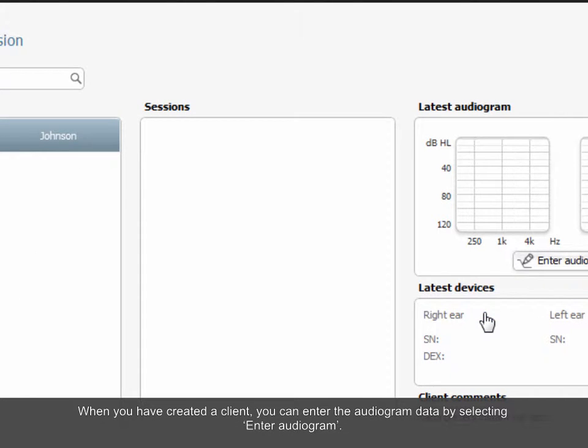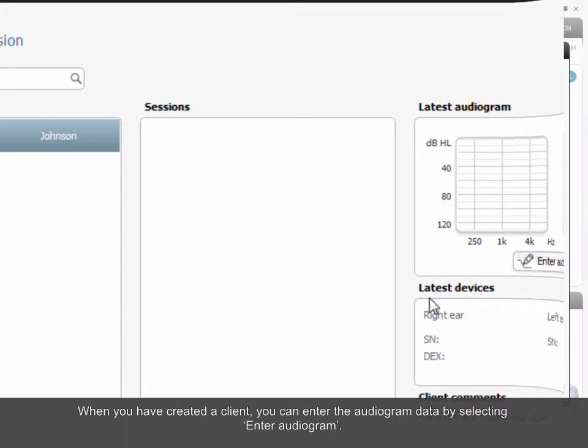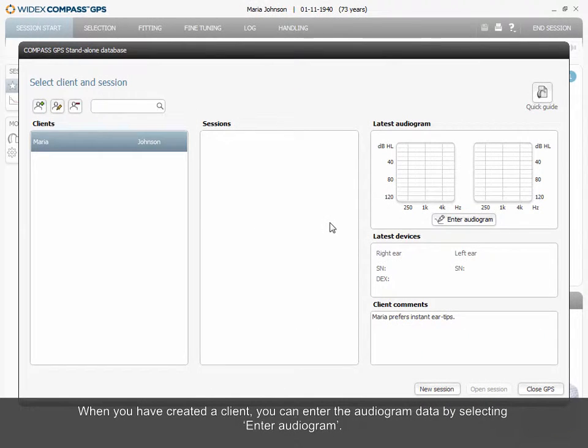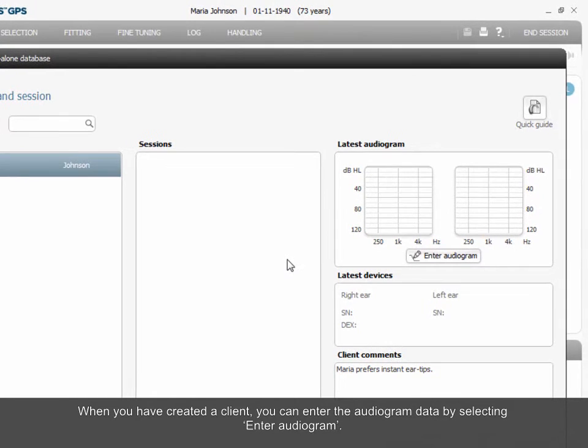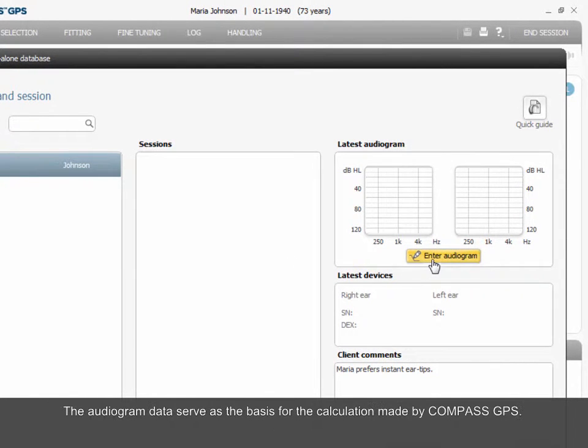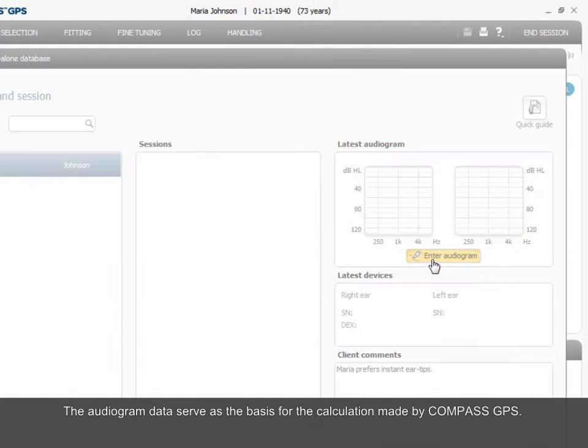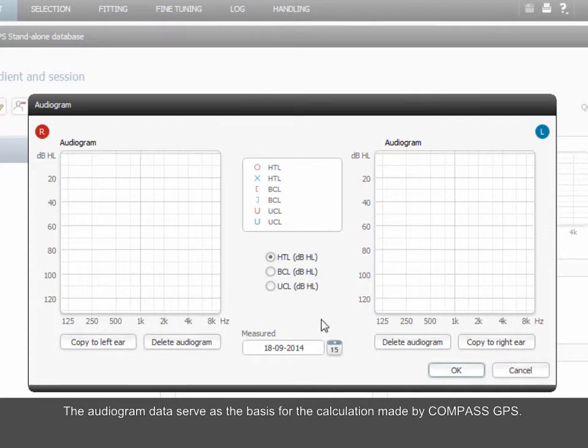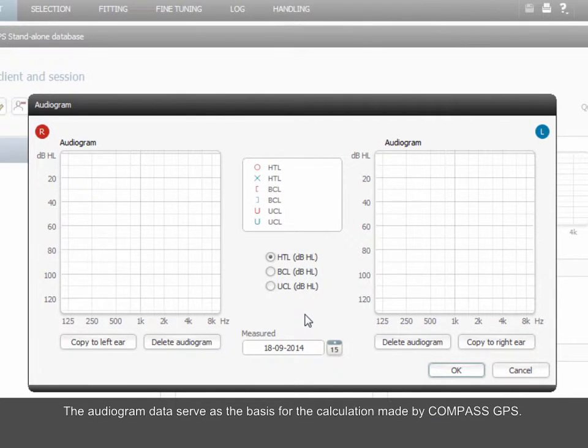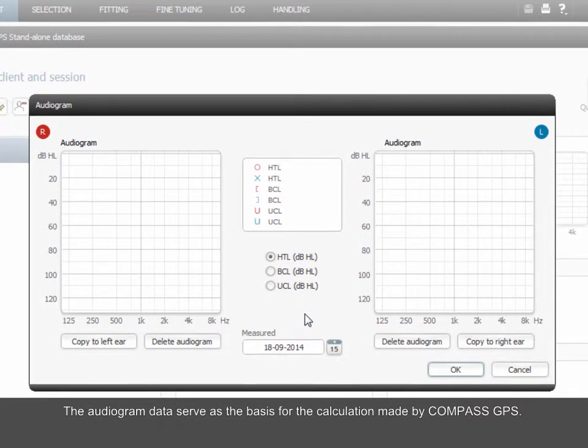When you have created a client, you can enter the audiogram data by selecting Enter Audiogram. The audiogram data serves as the basis for the calculation made by Compass GPS.